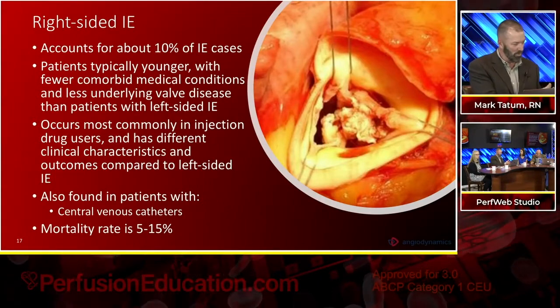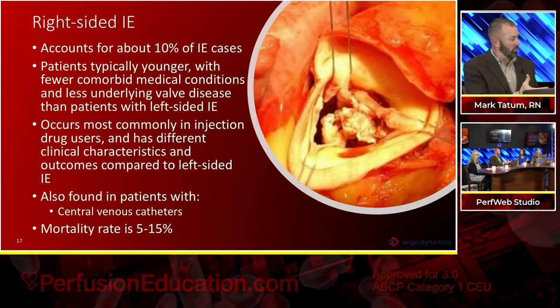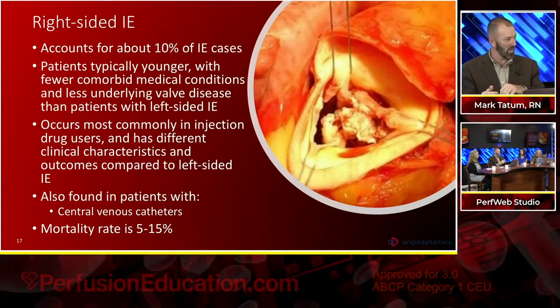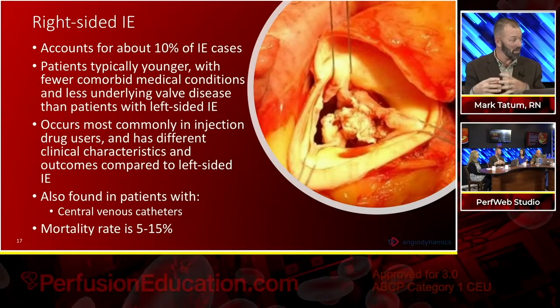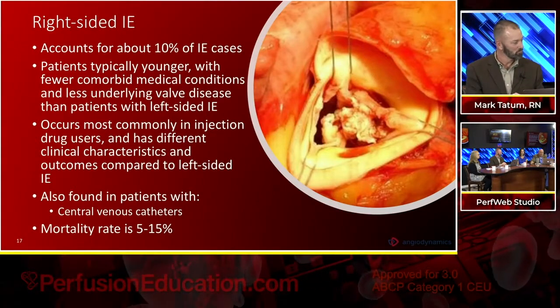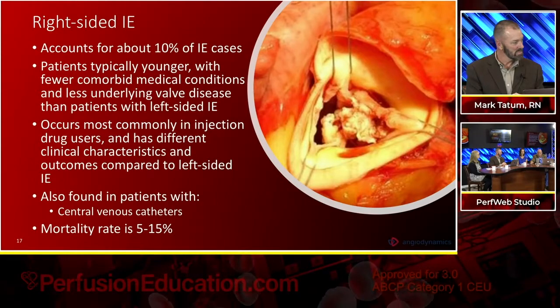Blood cultures, thank you very much. No problem, in the blood cultures. So it really did change the practice of the person who was in ID. Absolutely. They were treating Staph aureus, which they found, and they found 4 oral flora under the biofilm in the actual material. Completely changed their scope and what it is that they wanted to do. But debulking it in itself, you're greatly reducing the risk of embolization. Exactly. So just on its own merit, it would change.